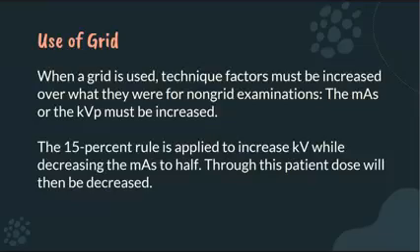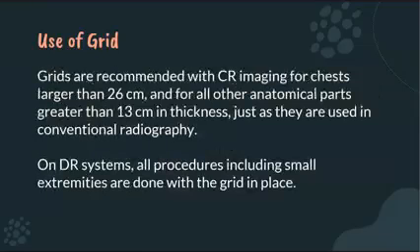Okay? So when we use a grid, it is proper practice to increase the radiographic technique, specifically the mAs and kVp. Okay? So if you remember, as I have said to you a while ago, on DR systems, all procedures, including small extremities, are done with a grid in place.